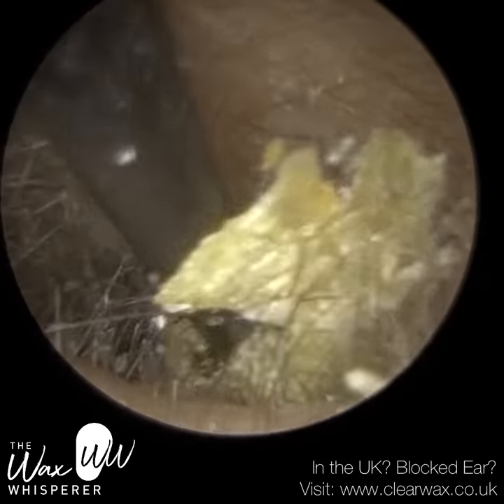This is where you need a good grasp of ear anatomy. As I'm bringing the hook out, the tip is embedded in the wax plug — I can't see it. I know with this patient that near the entrance I have to elevate the hook upwards, because that ear canal has a bit of a dip near the entrance. Again, a nice large piece — though it broke up again at the tail end.